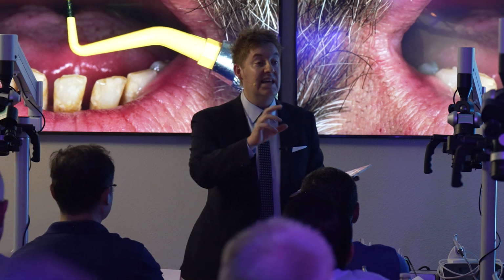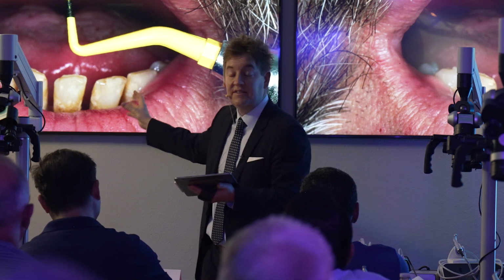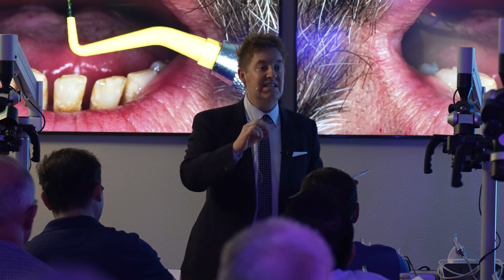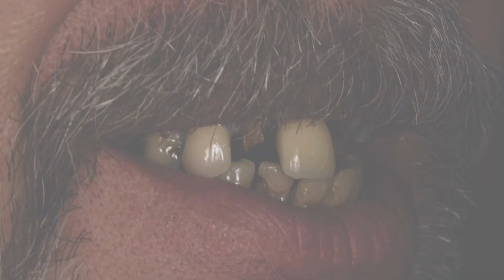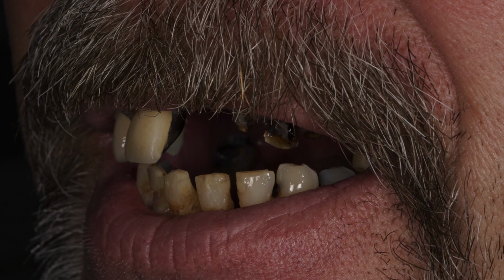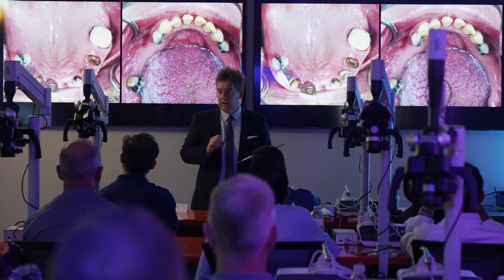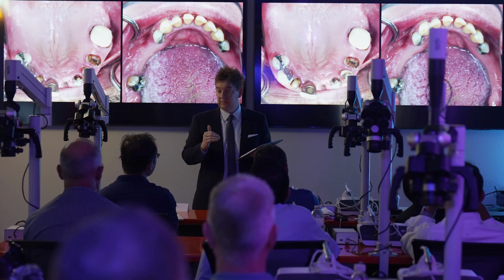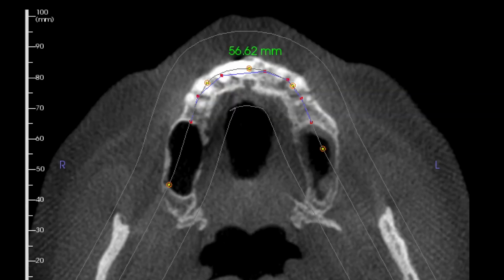And the minute I don't see any of it, I'm going to grab a measuring device of some sort, and I want to know how far negative he is. And you're going to notice he's about a -2. His right side, his left side, and his occlusal views. We're all in agreement that it's a terminal dentition and everything's coming out. So his RBH, his residual bone height from the crest of the ridge to the floor of the sinus in the posterior maxilla, is nil.